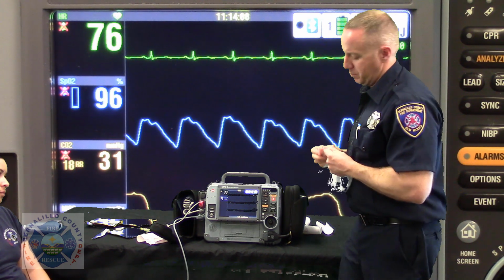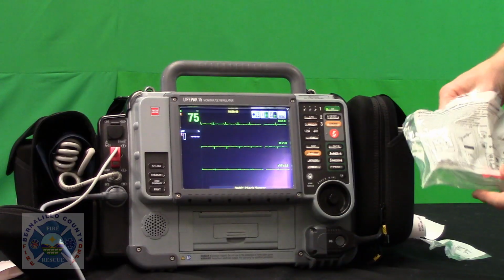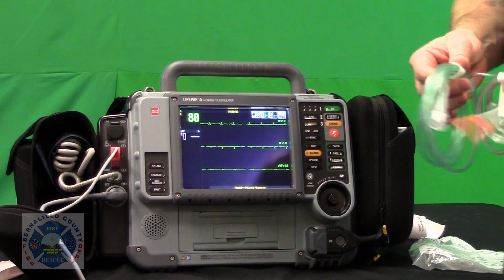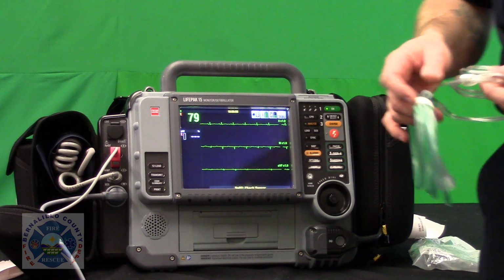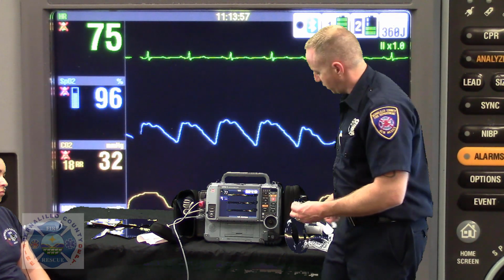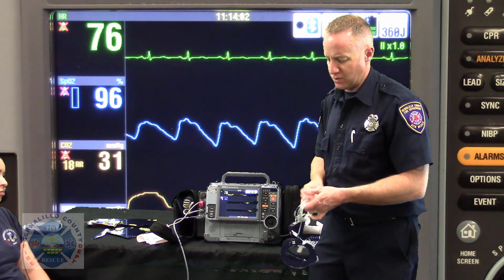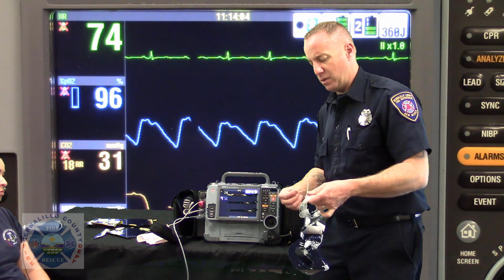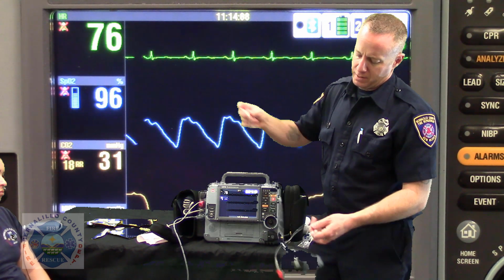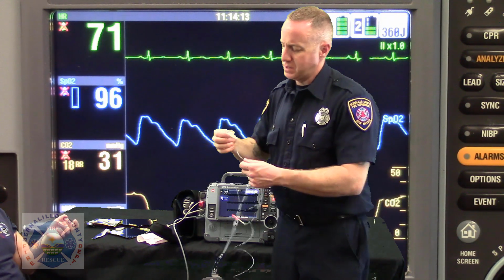You can run into some pitfalls with this when you're unpackaging it, so I just tell people to prepare themselves to unroll this correctly. What I like to do is go to the monitor before I go to the oxygen bottle, unwrap this and separate the two. You can see how, if you don't pay this out correctly the first time, it becomes sort of a headache to correct. So you want to find the way that the cannula is paying out. You're going to grab it, do one of these jobs right here and separate it. Otherwise it becomes a tangled mess.